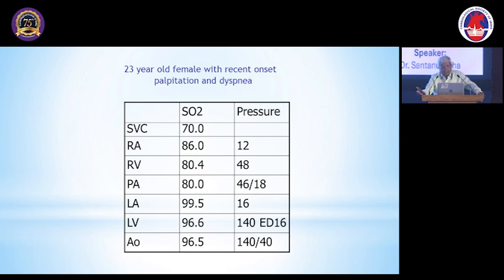No, sir. Look, RA saturation has gone up. Sir, RSOV. RA pressure has gone up. So this is, and you have a widened pulse pressure. Everything is pointing towards an RSOV opening into the right atrium. Okay.